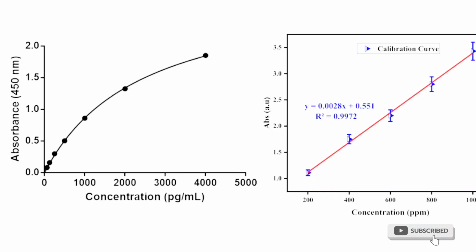Okay. If you look at this as well, that's what I'm trying to say: if you've seen my video on the calibration curve, you are going to see that this is the same thing here. This is a calibration curve, and you want it to be as close to 1 as possible. Again, look at it. This is absorbance, okay? So the highest absorbance here is about 3.5, okay? Then you can see the concentration as the case may be. What this means is that any result you are getting, up to this very 3.5, is going to give you a concentration.